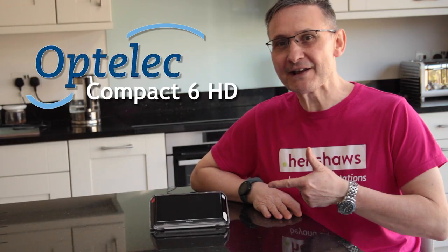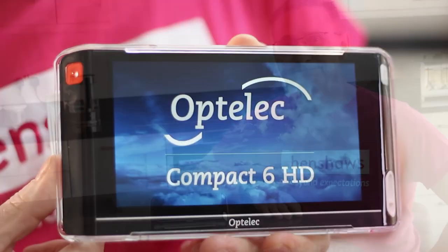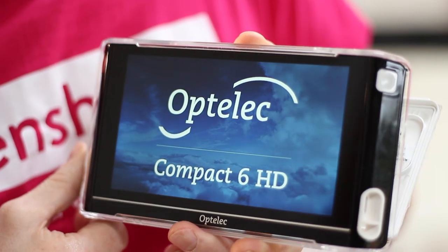Say hello to my little friend, the Optelec Compact 6HD. They've got various sizes but this is the 6 inch — a really portable solution. It's got two cameras. Camera one is for the desktop mode, which is the usual mode really, and it's got a holder so it actually sits nicely on the desktop so you can scan and slide the reading material.